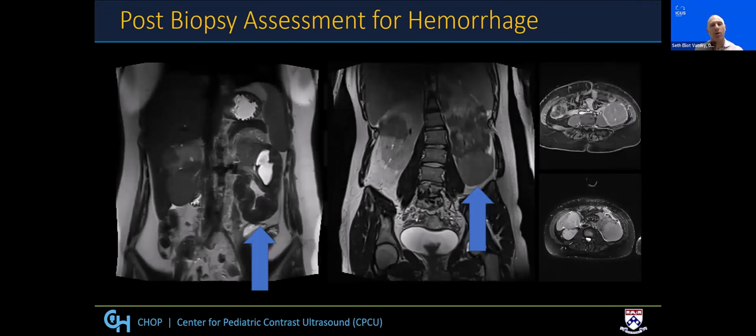Contrast-enhanced ultrasound can also be used as an adjunct technique to assist in post-procedural management. This was a 19-year-old female with a history of severe tuberous sclerosis and mid-aortic syndrome and bilateral angiomyolipoma. She had seizures and extensive behavioral issues. Now, I had treated her AMLs previously with selective renal embolization about 2 years prior to this MRI, and there was initial bulk reduction in the AML.